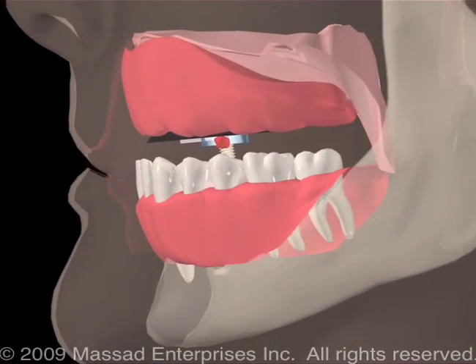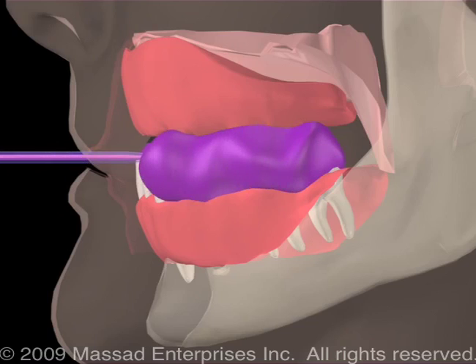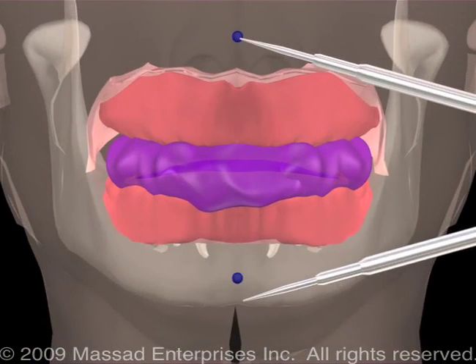of the pen. The patient is then asked to close into the depression while the practitioner injects a bite registration material. We suggest a polyvinyl siloxane impression material which will set very firmly and will have no bounce after set. We are now reestablishing that we are at the correct occlusal vertical dimension with the desired 3 mm freeway space.